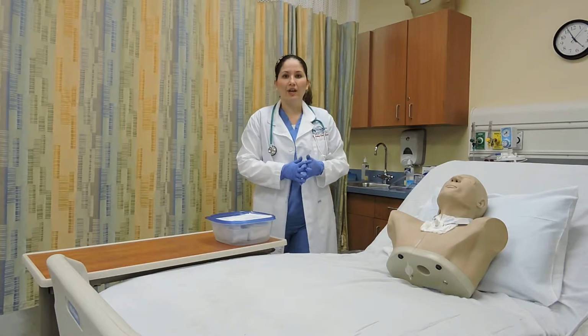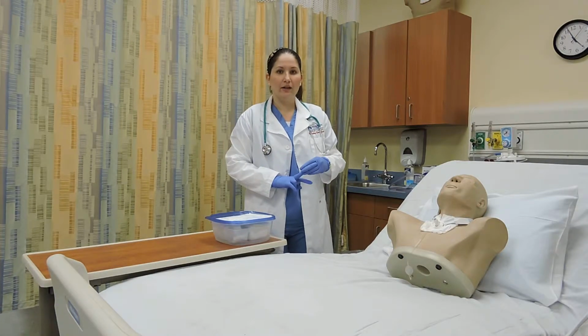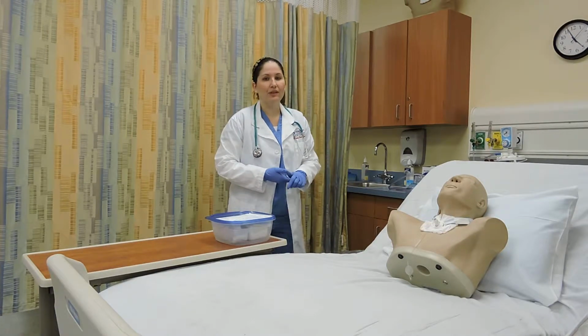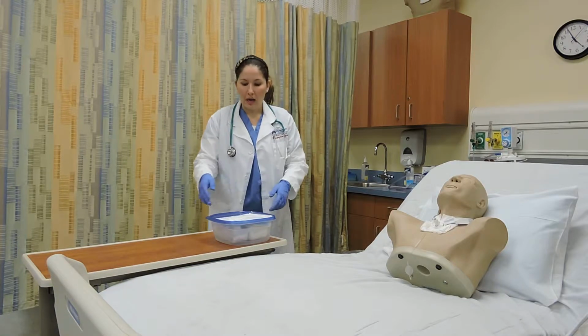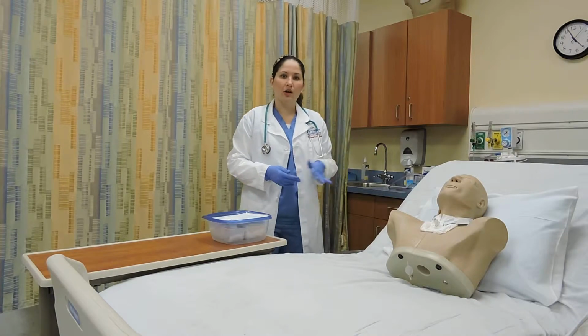Now I'm going to check that this is the right patient by using two patient identifiers, the name and the medical record. And I'm going to gather the necessary equipment. For this video, I'm going to need a trach care kit, a BVM, and a suctioning source in case we need to suction the patient.